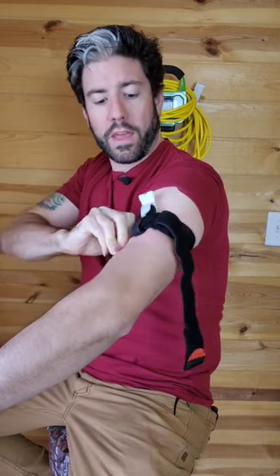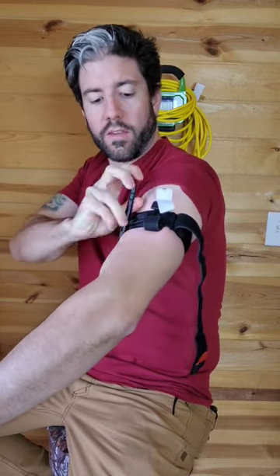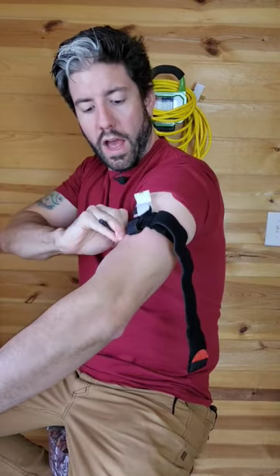There are reports of these failing in Ukraine right now, and they're requesting American-made tourniquets because these Chinese-made ones are not reliable.